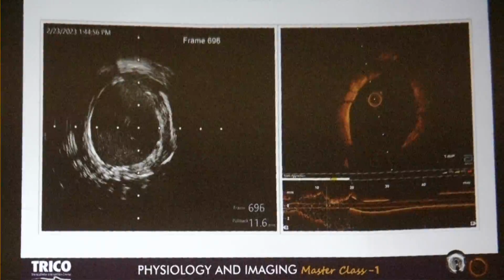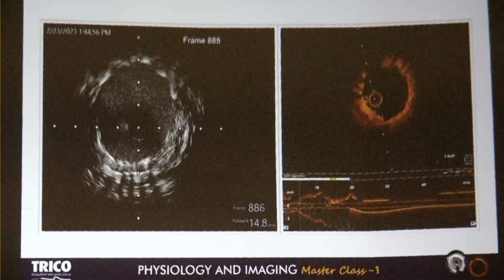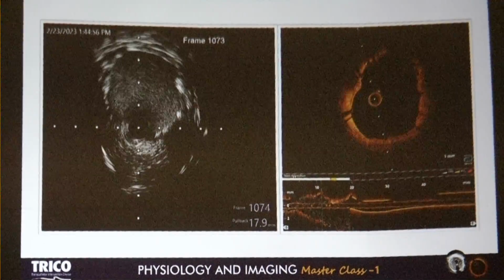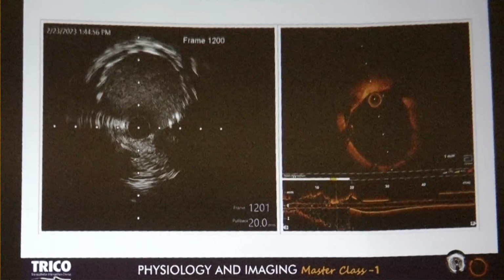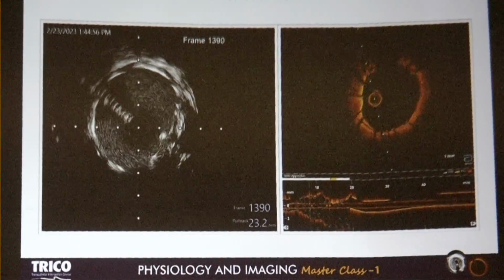At least I feel that we have given a good lumen. At 6 o'clock there is something, overcrowding of the stent struts, and possibly, yeah, but see, you cannot fix the whole aneurysm, and you should not, because in the process, if you cause stent fracture, then you are giving a grave prognostic problem to the patient.